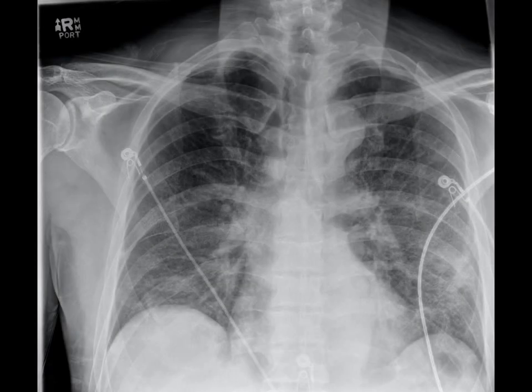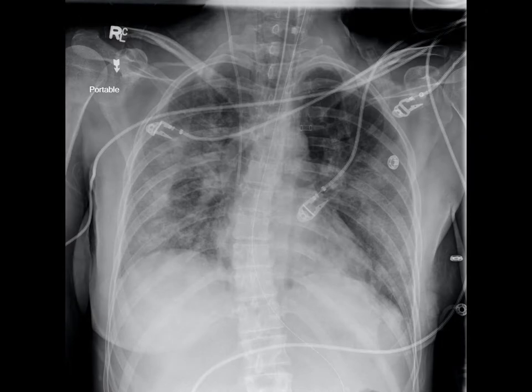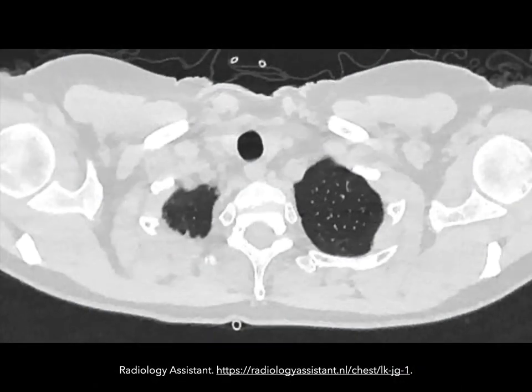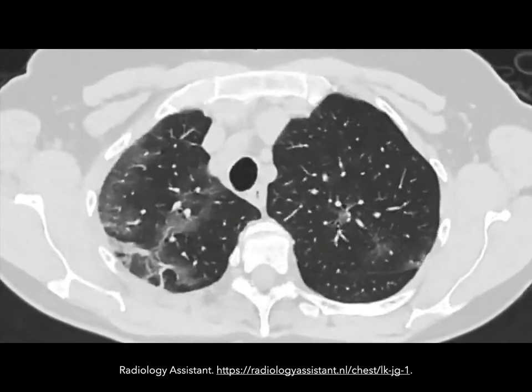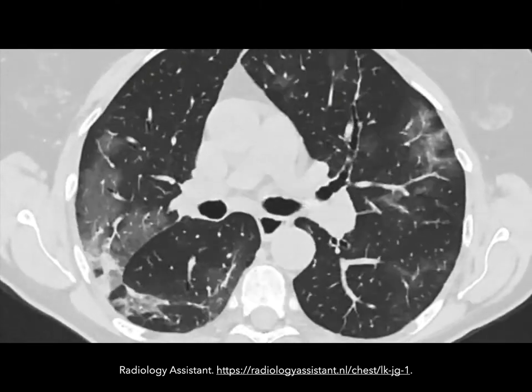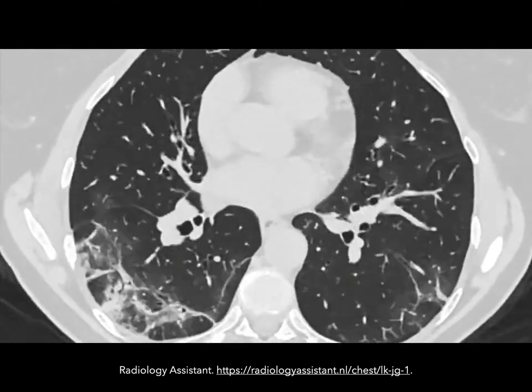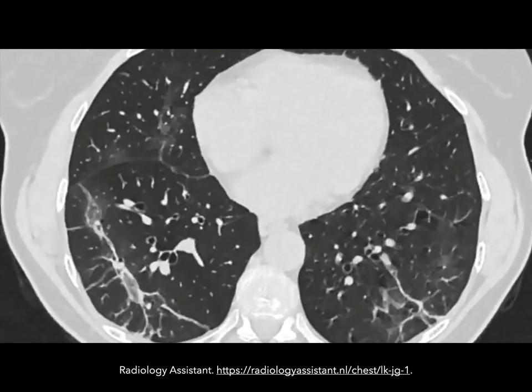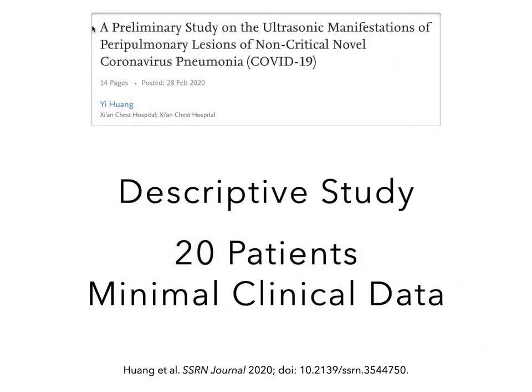Let's move on to our second objective — lung ultrasound findings in COVID. Here are chest x-rays of a couple of patients I've seen recently that needed admission for COVID. They both have an appearance of patchy interstitial infiltrates affecting both lungs. And here's the CT scan of a patient with COVID demonstrating ground glass opacities and interlobular thickening. Understanding these radiographic findings will help us better understand the appearance of COVID on lung ultrasound. However, keep in mind this is a topic with minimal evidence at this point in time — the current evidence base is a small number of papers including a study, two letters, and a couple of case reports.